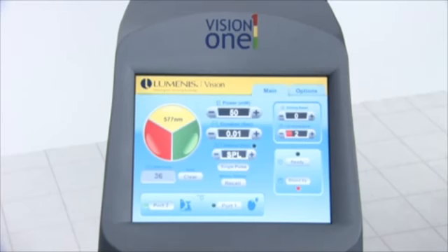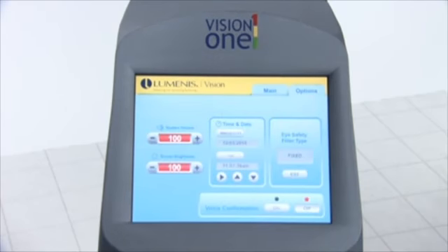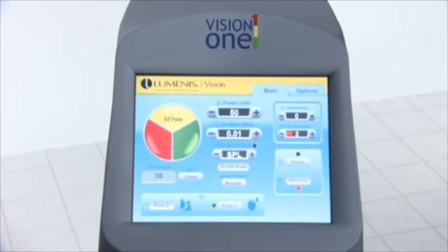To select voice confirmation, press the Options tab to view the options screen. Press the On or Off button in the voice confirmation field to activate or deactivate voice confirmation. Then, press the Main tab to return to the treatment screen.